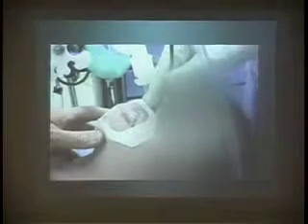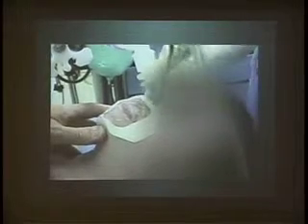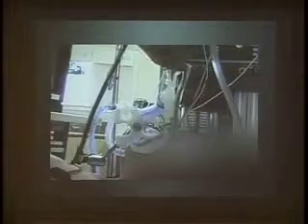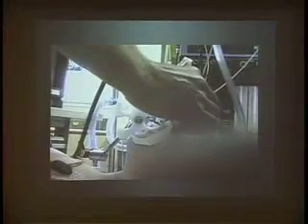This is a trainee, second intubation. While maintaining position of the scope right above the carina, the endotracheal tube is lubricated and advanced to the nares. Gentle forward pressure with continuous twisting facilitates passage through the nares and vocal cords while minimizing trauma. And there are some specialty tubes for fiber optic intubation. A 15mm endotracheal tube adapter can be reattached.